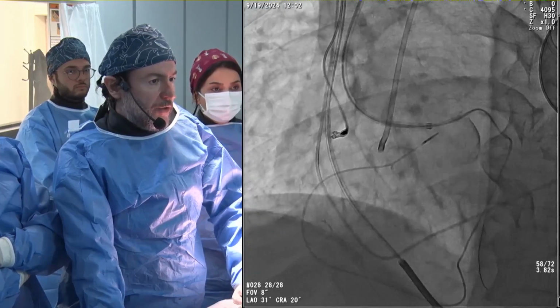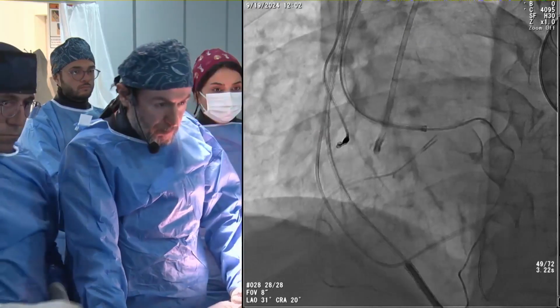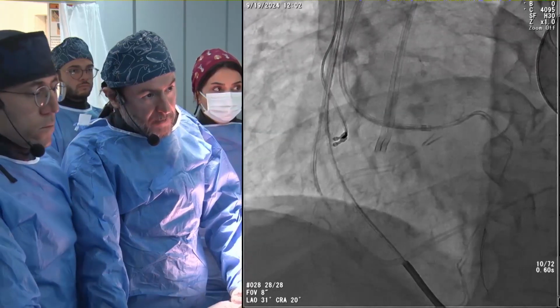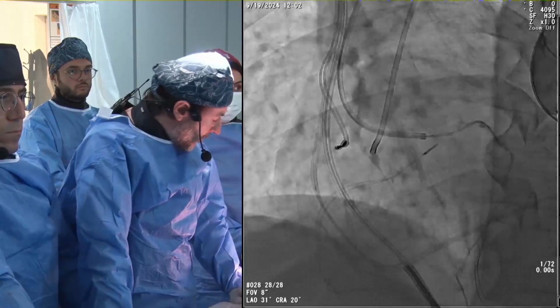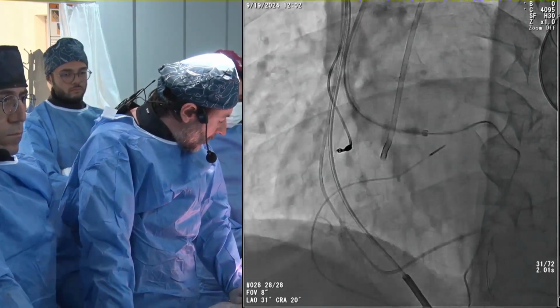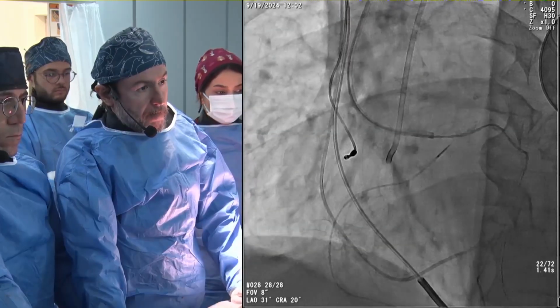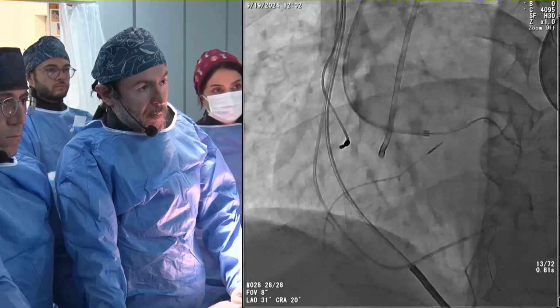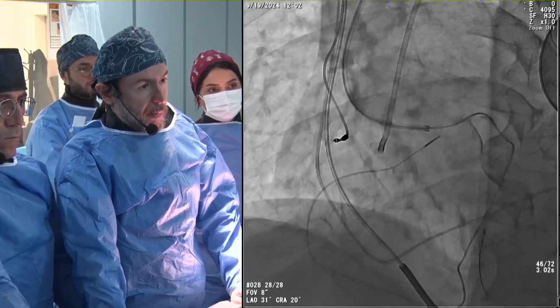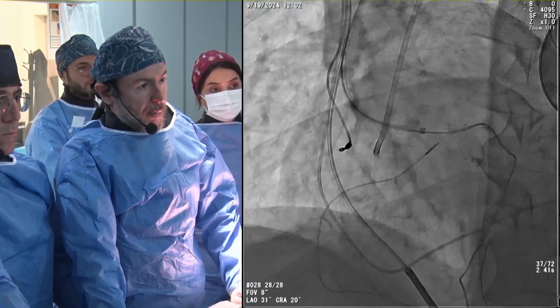And we think we are in the aorta. What do you think? At least we have blood coming and the blood is red, but it can be still. So if you go LAO and it's posterior, that means you are in the aorta. You can confirm that. And you go RAO, like the PA is always anterior to the aorta. So you just take an LAO, RAO, and that will tell you.